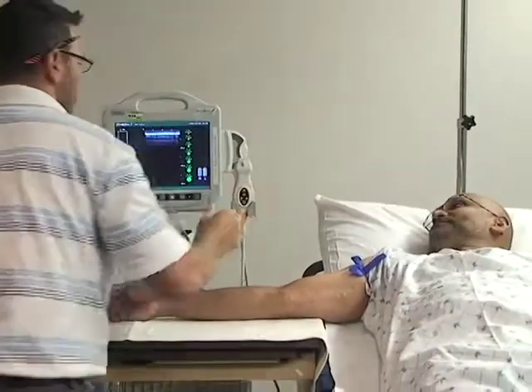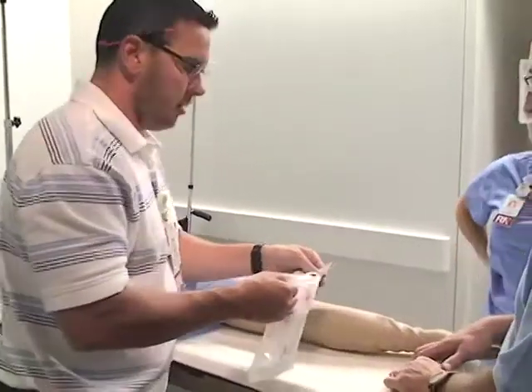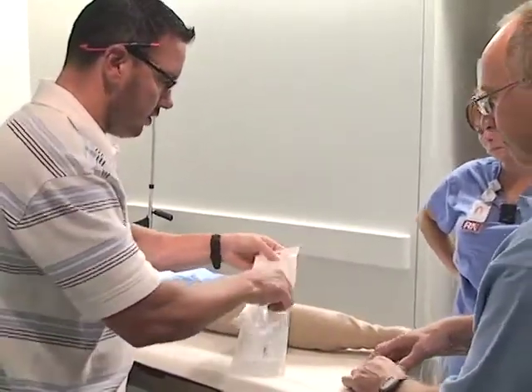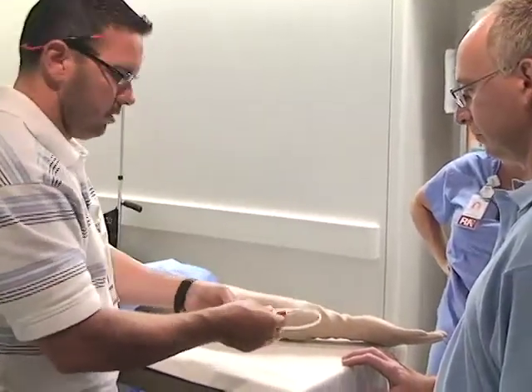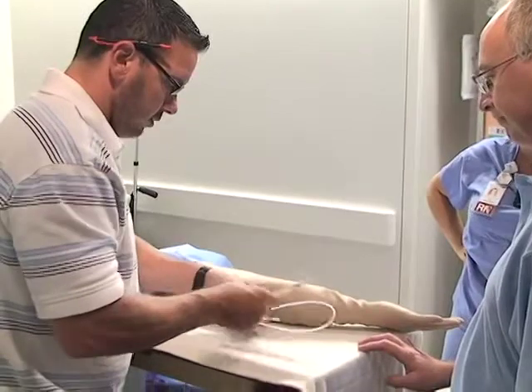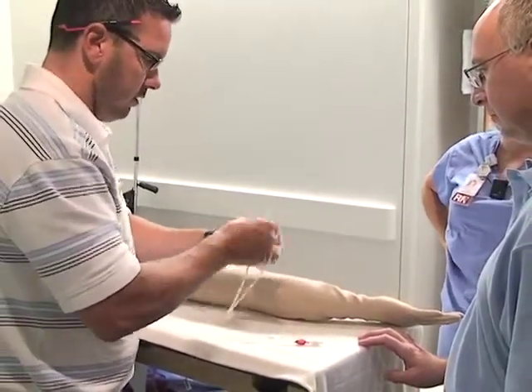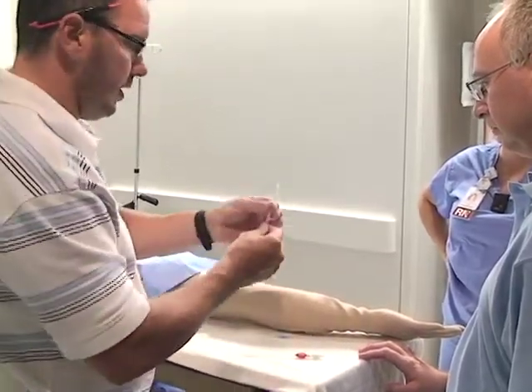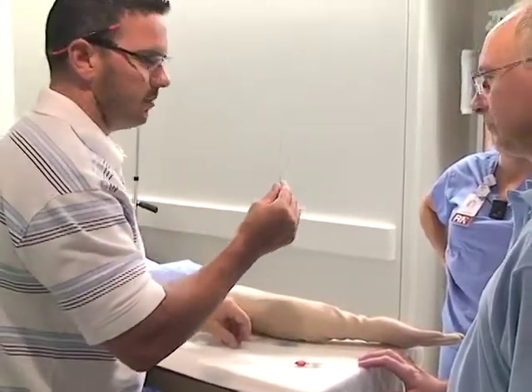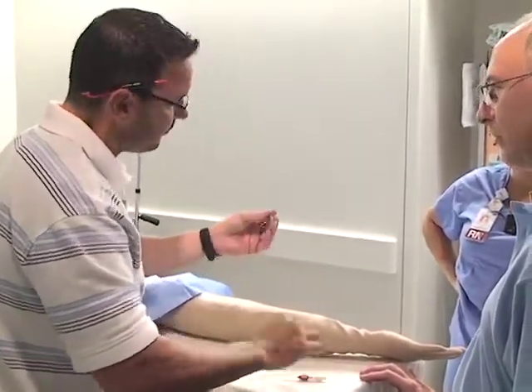All right. So now if you want to turn that off for a minute, Chris, we'll move to the actual stick. This is what is actually in the MST kit, and I'll show you once, and then I want everybody to get a chance to play with it. There's just three components: a sheath, a needle, and a wire. So what you do is get your needle. Be careful with this, because it's a real needle and it's sharp, so nobody gets hurt.